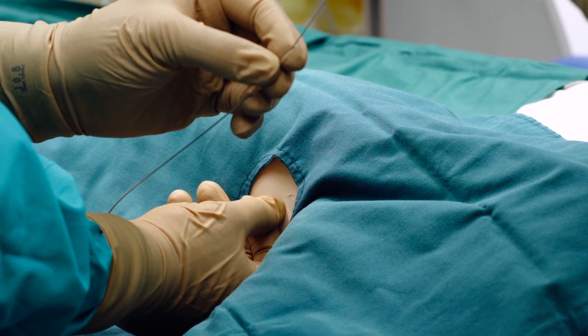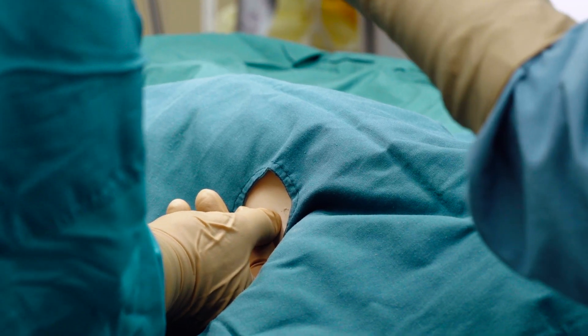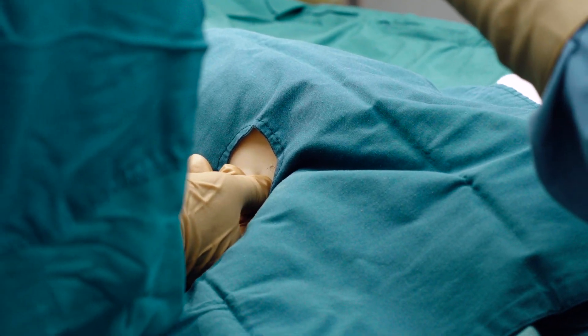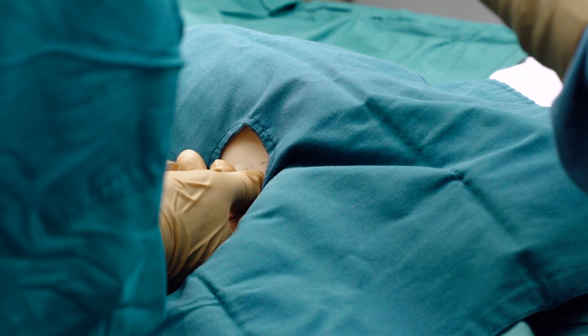Pass the first dilator along the wire, through the skin about one centimeter, angling anteriorly, then remove the dilator. The skin may require a small incision. It is important that the wire is held still at all times and not advanced or withdrawn.